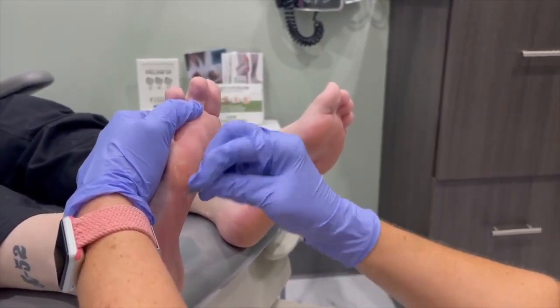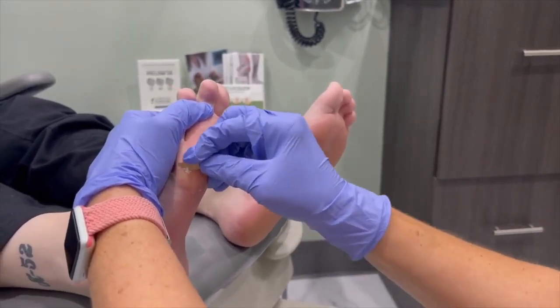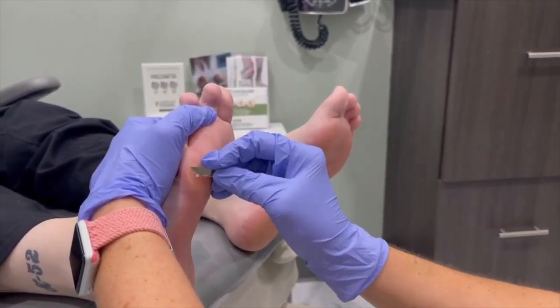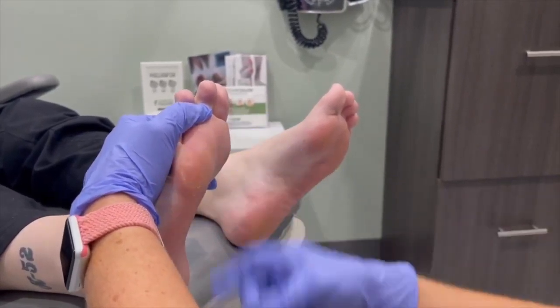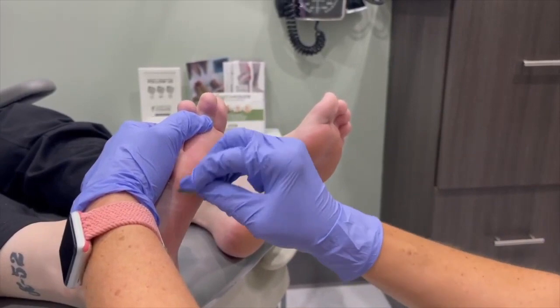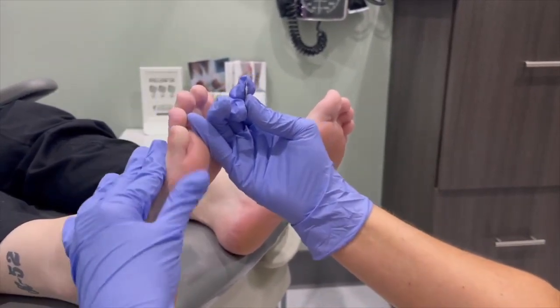She puts lotion on her feet every day, and that does help. It's making the callus a lot softer to trim, and it just kind of peels away. When you start to see that rebound, when I push, it turns white. When I let go, it turns pink. That kind of means we're at the stopping point. That's one of the most common questions I get asked: how do you know how far to go? And it's different with everybody, but in young, healthy skin, that's how.